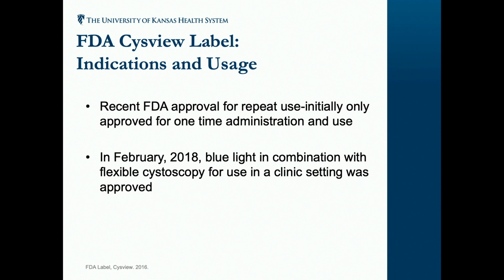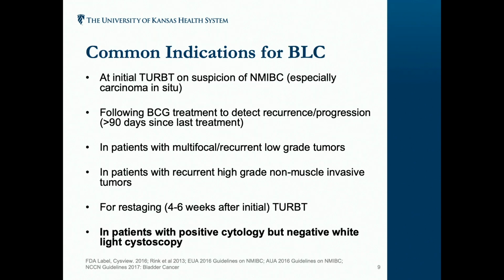And also in February 2018, the flexible blue light, what you would use in the clinic, and I'm going to talk about that in a few slides in a minute, got approved for use as well.